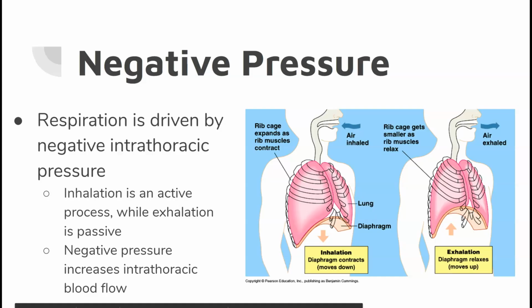So I like to say CPAP is like the duct tape of respiratory solutions. They've changed the protocol, so pretty much anyone who's having serious respiratory issues, respiratory distress, you can put on a CPAP regardless of whether or not they have fluid in their lungs. The idea is that it will open the lungs through that extra pressure and keep them open so that gas exchange can occur.